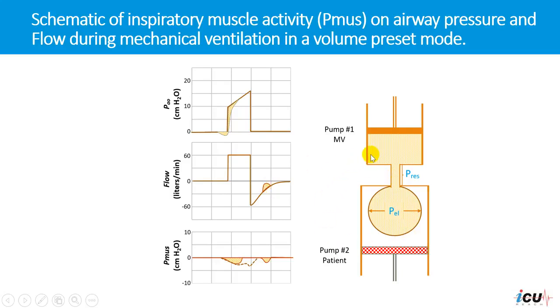So it is very important that we look at the respiratory system as a dual pump. The first one is mechanical ventilation and the second one is the patient. Our intention would be always to minimize sedation for the patient so he can participate in breathing. The understanding of this dual pump would be of utmost importance when the patient is more awake and is able to breathe. Thank you.